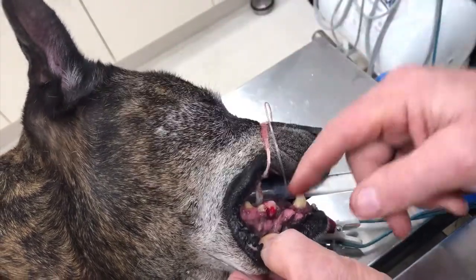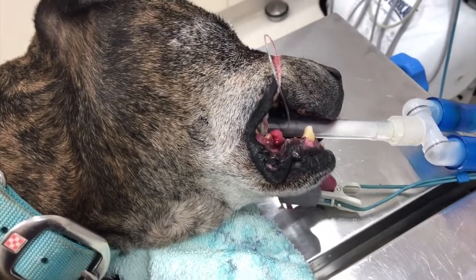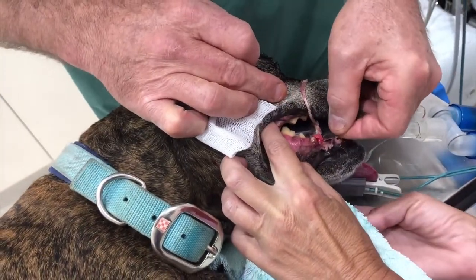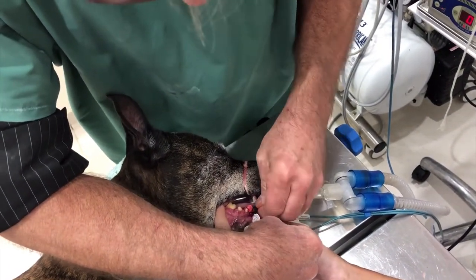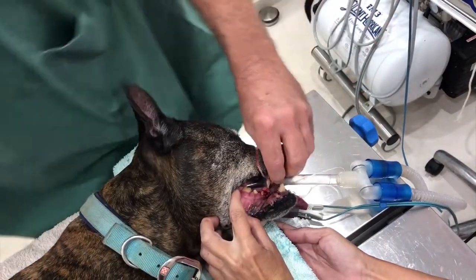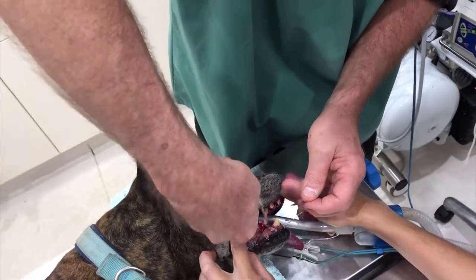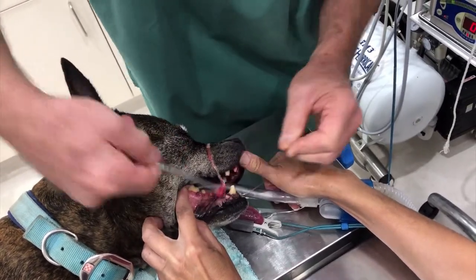We're about to cut this epulis out — you can see it's quite large. We're simply going to get in here with a scalpel and cut it out; there's nothing fancy about this. It is causing all sorts of issues just by covering the teeth. This is not a malignant one like Jack's, so we don't have to do a jaw amputation — this is simply a growth of soft gum tissue.